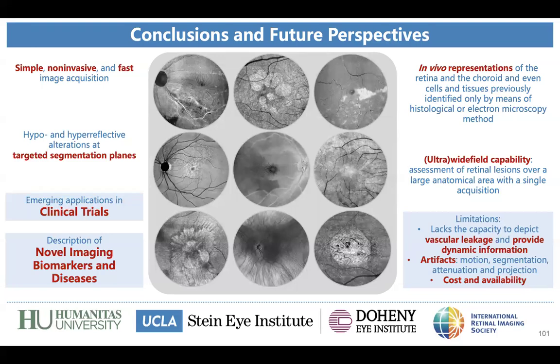There are some new technologies for OCT devices, and Heidelberg has the HD OCT that I'm not sure, but I think that they have 2.2 micron axial resolution. Also, we have some researchers using the visible light OCT that states that they have 1 micron axial resolution.